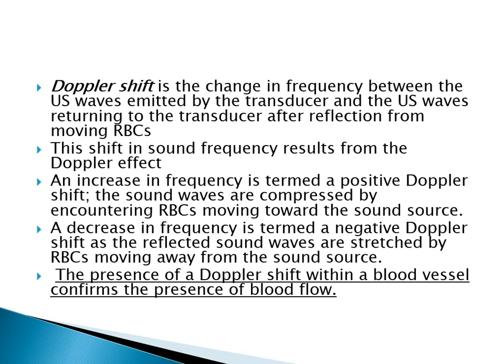You have the Doppler shift, a change in the frequency between the ultrasound waves emitted by the transducer and the ultrasound waves returning to the transducer after reflection from the moving RBCs. The shift in sound frequency results from the Doppler effect. An increase in frequency is termed a positive Doppler shift, as the sound waves are compressed by encountering RBCs moving toward the sound source. A decrease in frequency is termed a negative Doppler shift, as the reflected sound waves are stretched by RBCs moving away from the sound source. The presence of the Doppler shift within a blood vessel confirms the presence of blood flow.